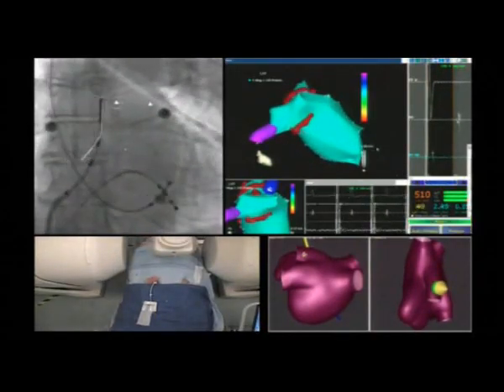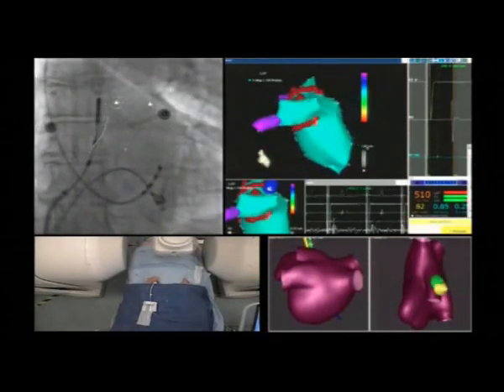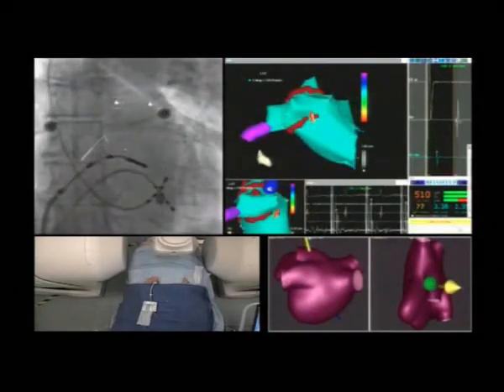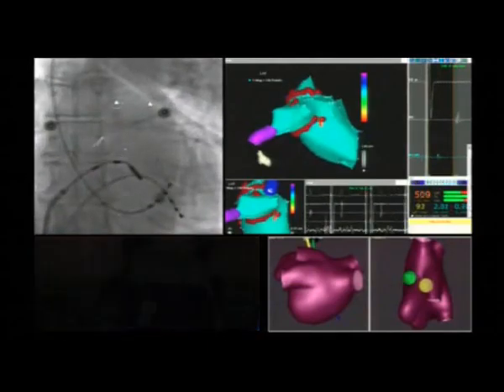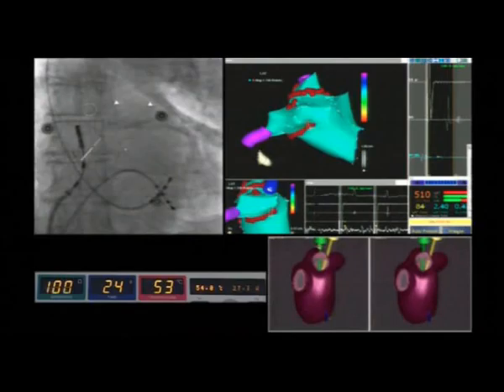The operator is now completing the circumferential line around the right pulmonary veins. As you can see, the right superior pulmonary vein has been taken off the screen in order to allow a better view of that region.